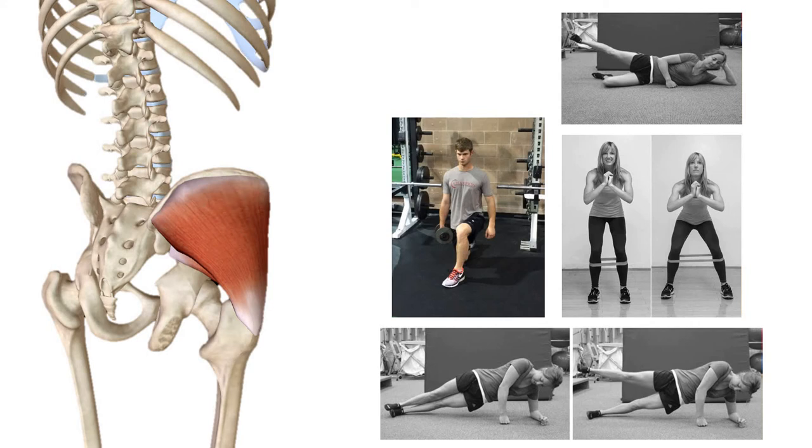And this is how we're able to quantify that and actually prove whether an exercise enhances the recruitment of the muscle. If it does, that means greater hypertrophy, that means greater strength. All of these exercises would benefit the hip abductor, but it's about which is the best, essentially, and in this case it's the contralateral lunge.